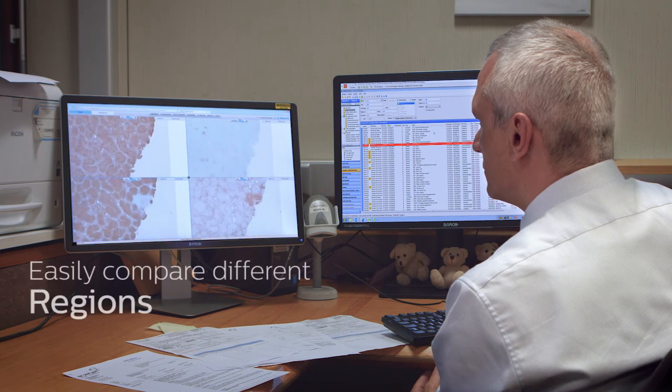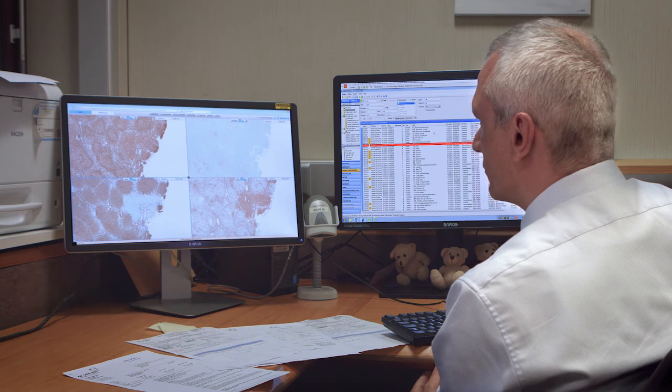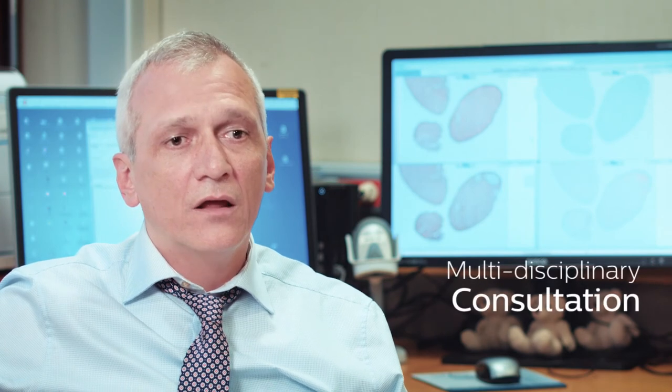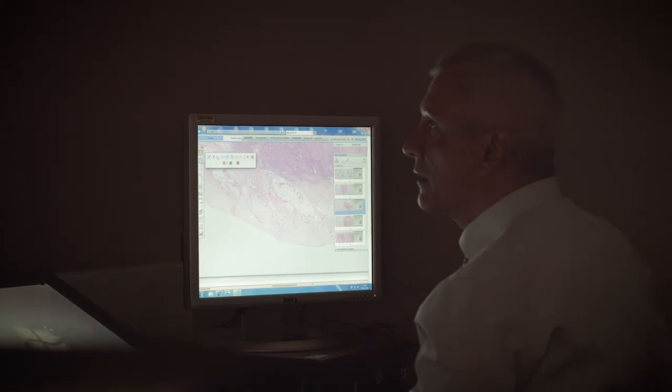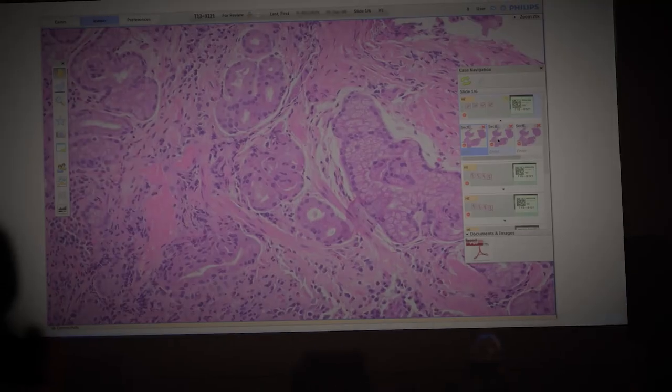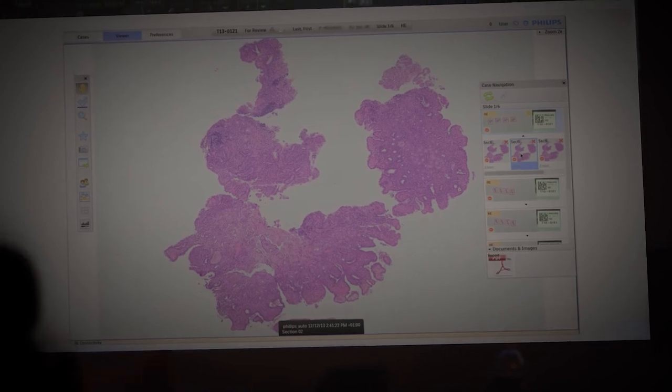It's very easy to compare different regions in the same lymph nodes. Another big advantage of digital pathology is multidisciplinary consultancy meetings. It's mostly in another location where we don't have the slides available, but with digital pathology this is history — we just log into the system and have all the slides available of all the patients being discussed.